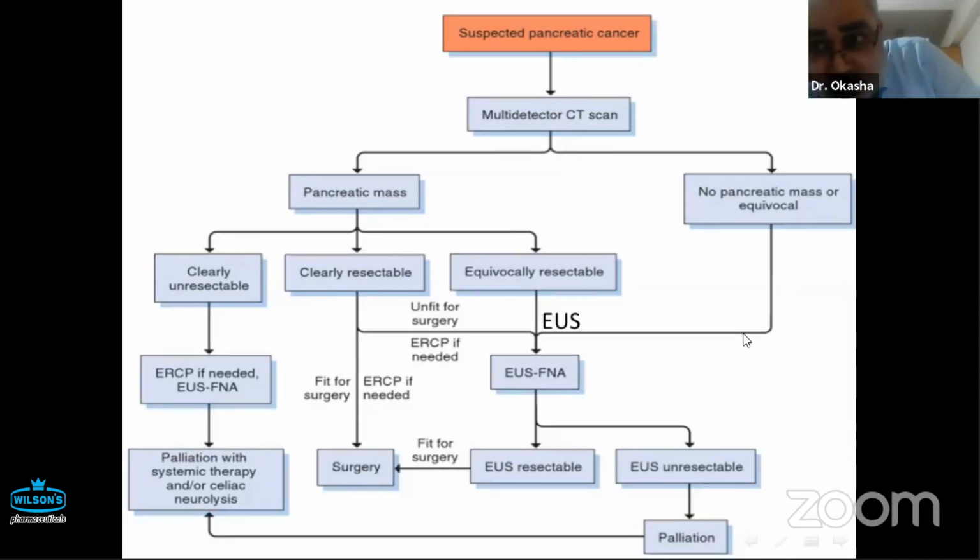Two patients is a very small number to judge, but the other 5 patients had EUS radiofrequency ablation for insulinomas, which is very effective in insulinoma. Later on it may become the standard of care because insulinoma, as you know, is a very benign tumor, very rarely producing metastasis. So if you burn 80% of the volume of the insulinoma, then you get rid of 80% of the patient's problem, and you can do it a second time or twice. That is in contrast to duct adenocarcinoma. If you leave 1% of the tumor, the very aggressive tumor will grow again.